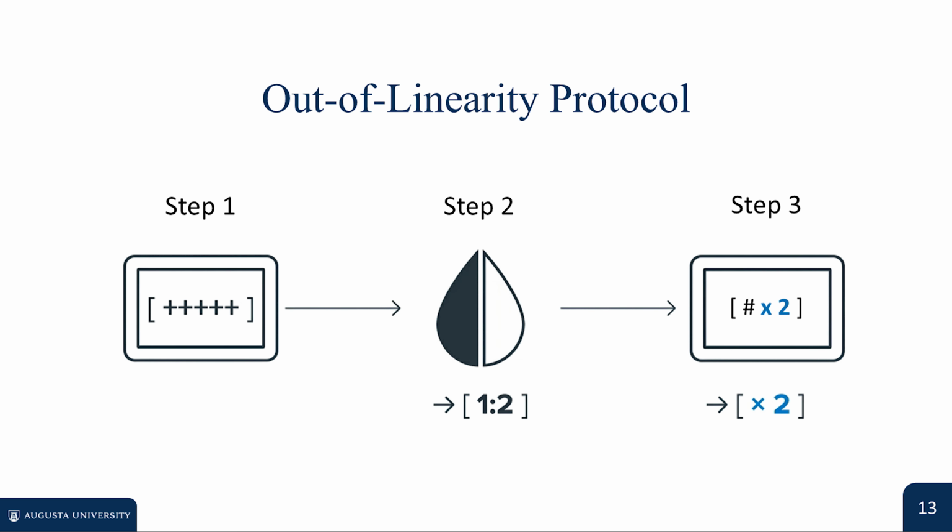In step 3, the diluted sample is reanalyzed, and all directly measured diluted parameters, including WBC, RBC, hemoglobin, and platelets, are multiplied by the dilution factor of 2. If extreme leukocytosis is present, the RBC count must be mathematically corrected by subtracting the WBC contribution, and a spun microhematocrit should be performed on original undiluted blood to recalculate indices accurately.